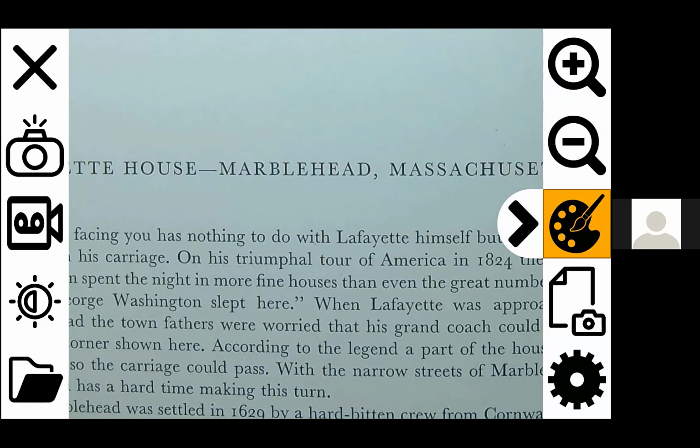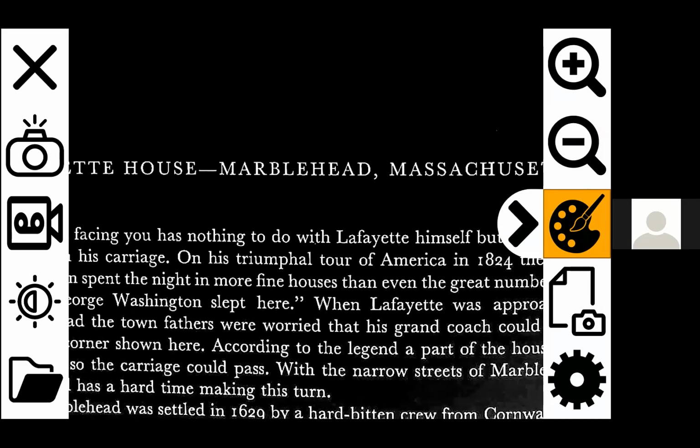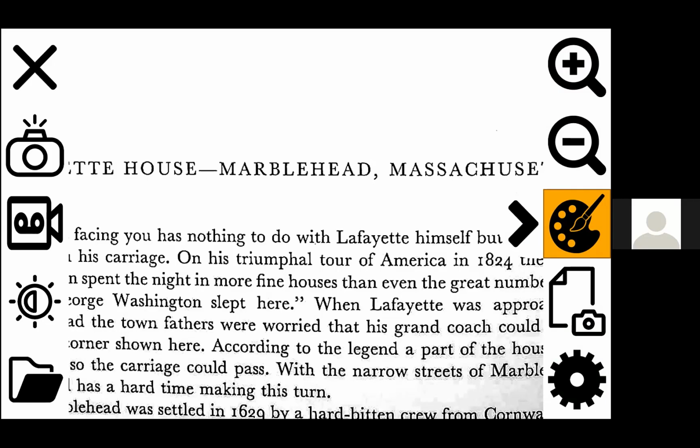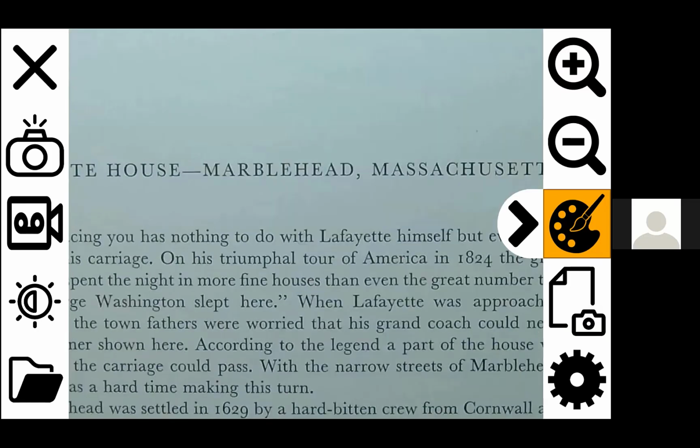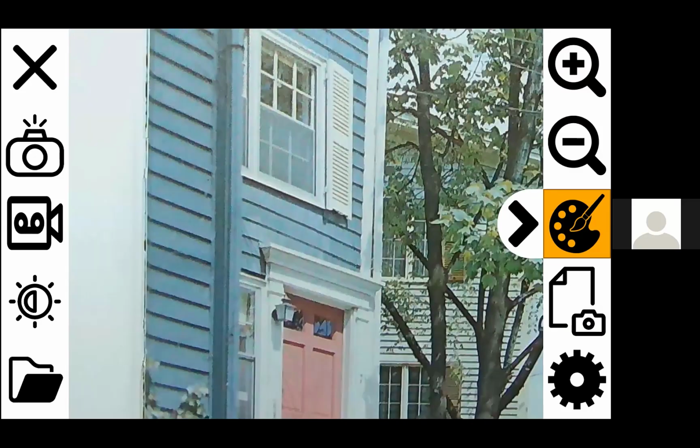Below that, I feel like that's a Bob Ross painter's palette of colors. That's going to allow you to swap your color contrast. I just swapped over to high contrast, and then I've got white text on a black background, then black text on a white background, and then back to true color. I'll show you that that's true color by showing you an image of a house there.